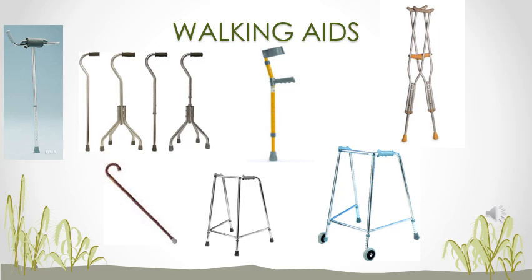The bottom left is a walking stick or a cane, but your patient will know it as a walking stick. Next to it, a walking frame. Notice how it has got the rubber tips on the walking frame, where the walking frame to the right of that one has got wheels in front.